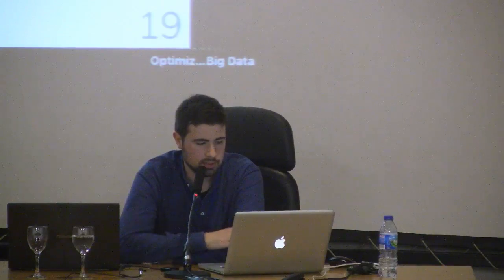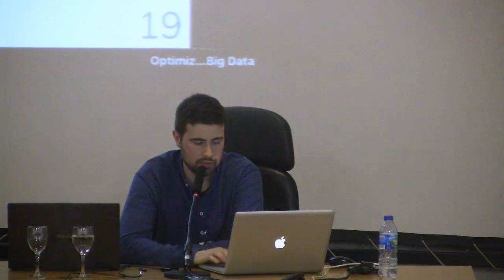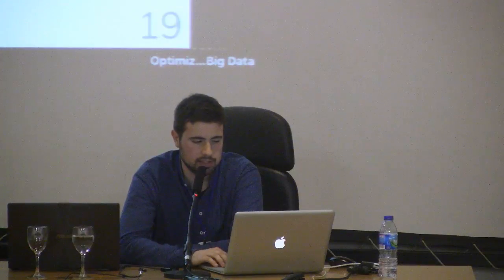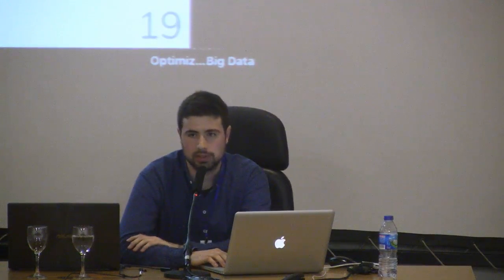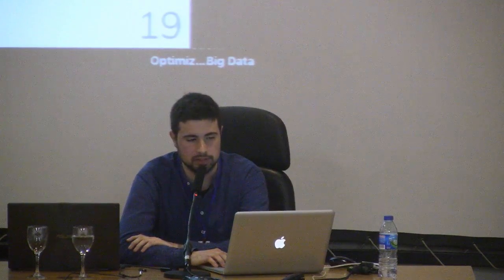So as I said, the assessment is just going to compare what your tool produces, so the age that your tool predicts, against some unseen T1 images. And then there will also be a bonus for the ones who detect Alzheimer's patients, and a penalty for those who produce false positives for the Alzheimer's patients.